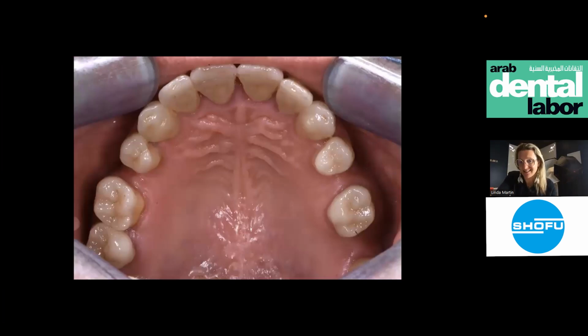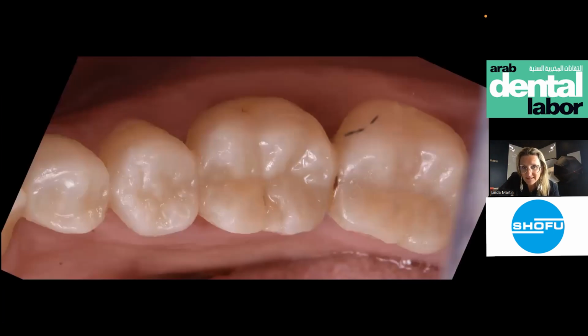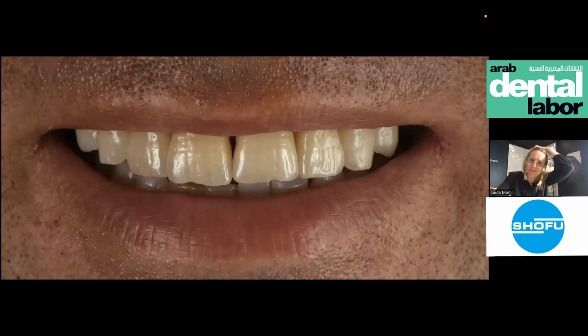So this is the upper edge at the end. If you look well, you can see the different veneers. This is the lower edge, and I have to be sincere, I can't do composite like that. For me, it's impossible. Can you see? It's beautiful. And this is the strongest composite that we have. It's not liquid composite, it's not flowable. It's the really strong composite that we have. It can last for a long time. It's made for that. So this is the smile of Olivier at the end. It's easier to have a smile now.